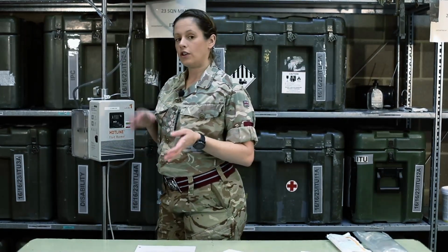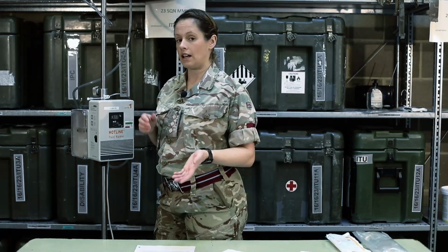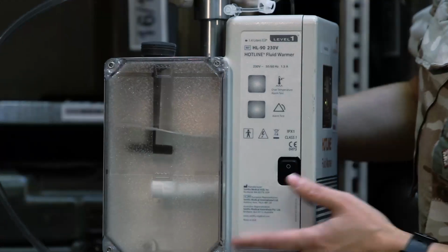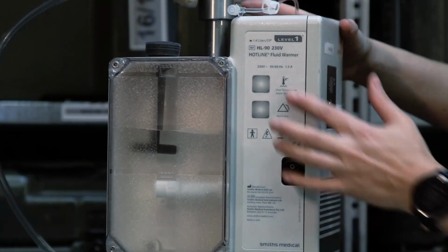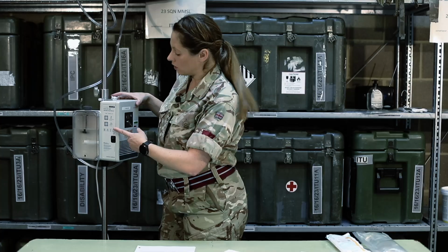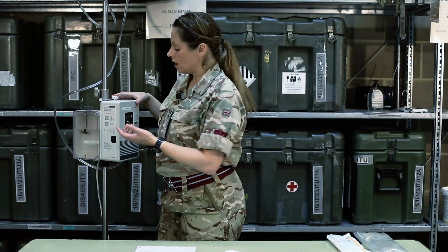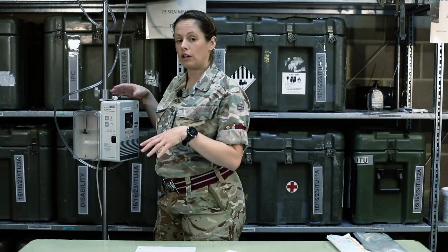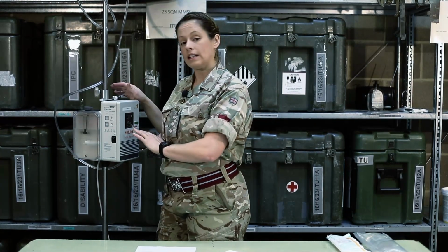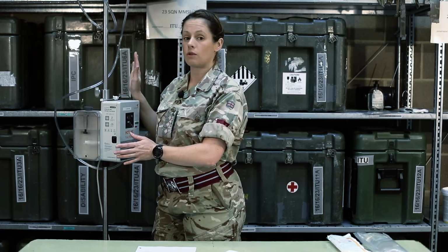Whilst I'm waiting for the Hotline fluid warmer to get to 41 degrees, I can test the alarms. On the side of the machine, there are two buttons: an over temperature button and an alarm test button. I'm going to press and hold the alarm test button to make sure that everything's working well. What I'm expecting to hear is an audible alarm, the red LEDs to come on, the green LED to turn off, and for the water to stop circulating.